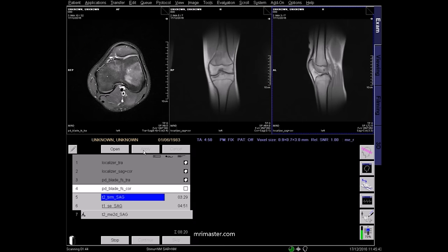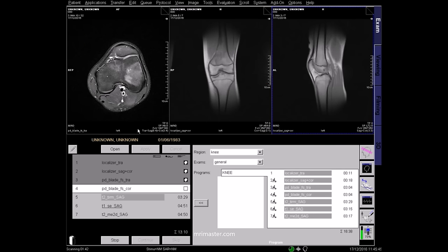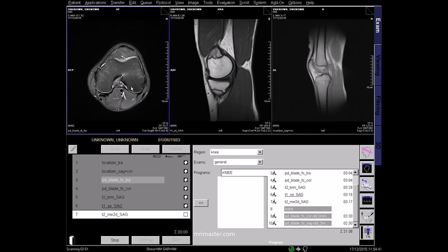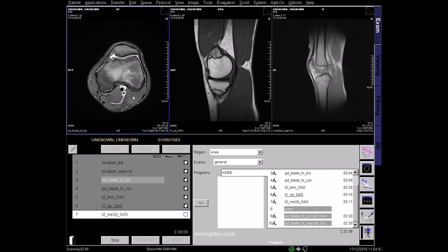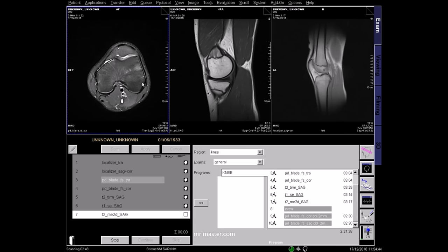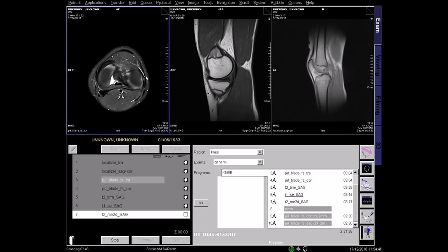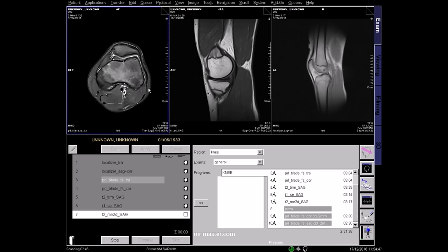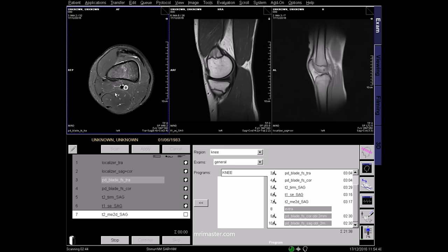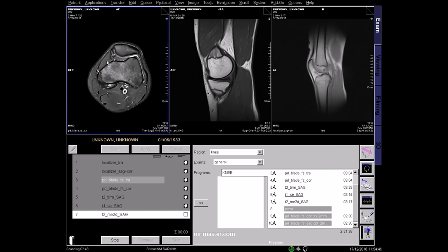Once planning is completed you should start reviewing your images. This is a PD fat saturated axial image where fluids appear bright and fat appears dark. Most infections and oedema in the knee appear bright in this sequence. PD fat sat sequences are very useful for visualising cartilage, ligaments, and bony oedema.